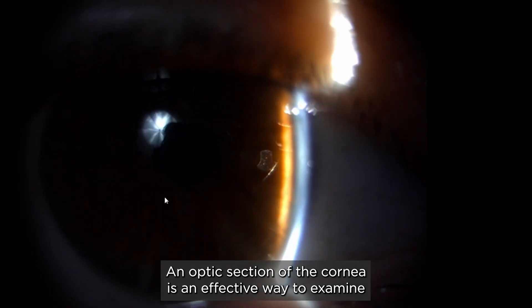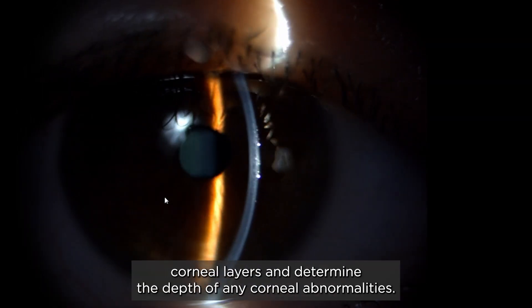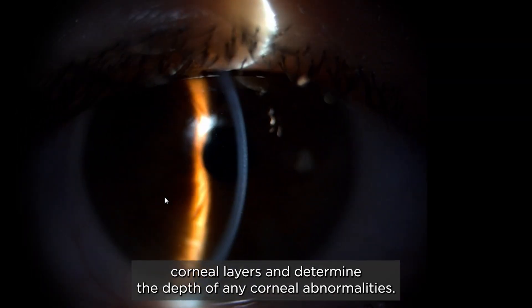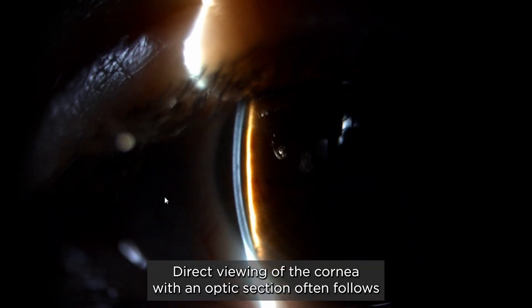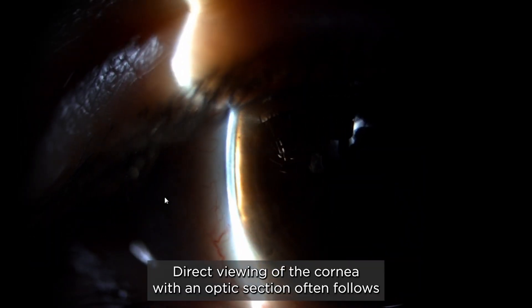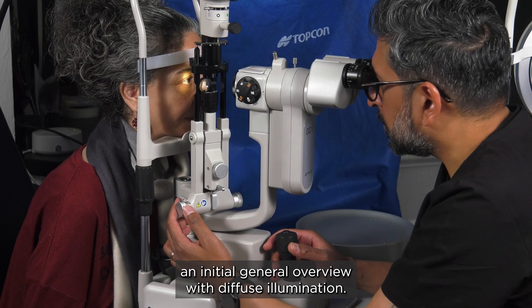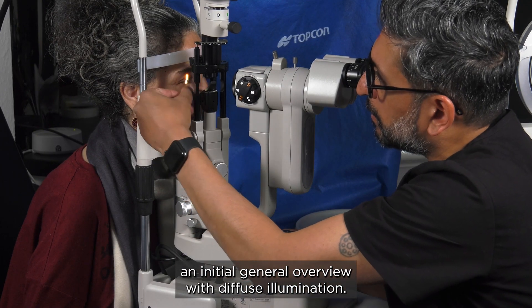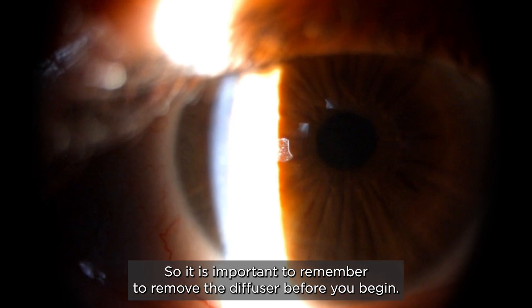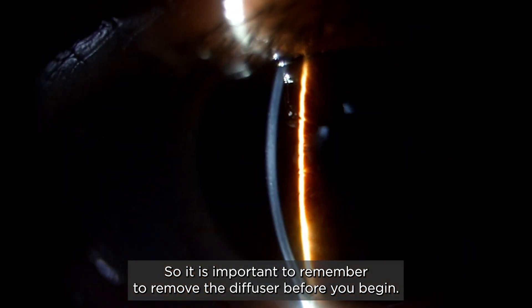An optic section of the cornea is an effective way to examine corneal layers and determine the depth of any corneal abnormalities. Direct viewing of the cornea with an optic section often follows an initial general overview with diffuse illumination, so it is important to remember to remove the diffuser before you begin.